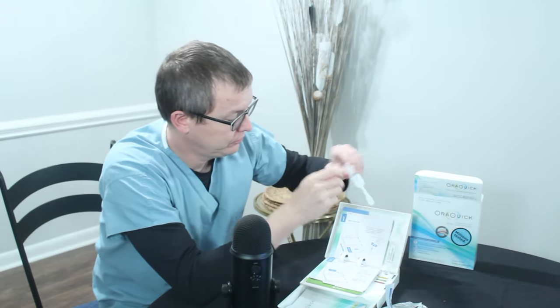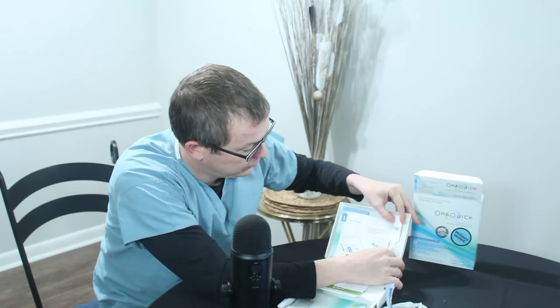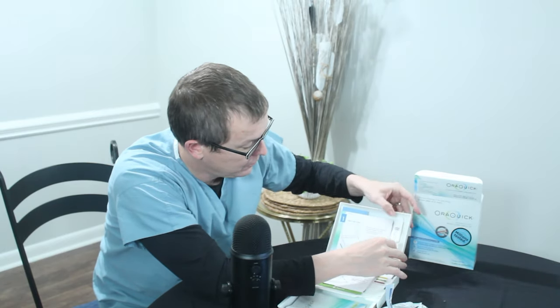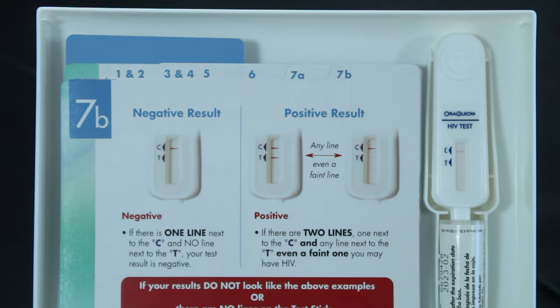Now you're going to put it in the test solution with the window facing out. You're going to wait for 20 minutes to get your results. Okay, so it's been 20 minutes — now it's time to look at our results.